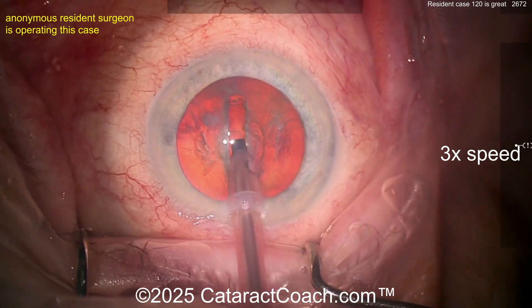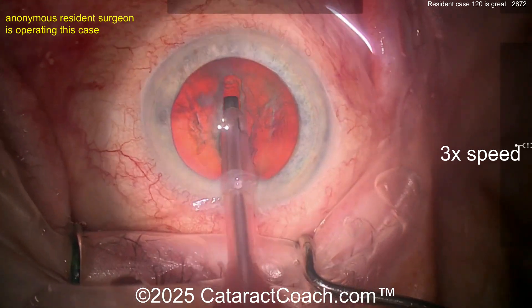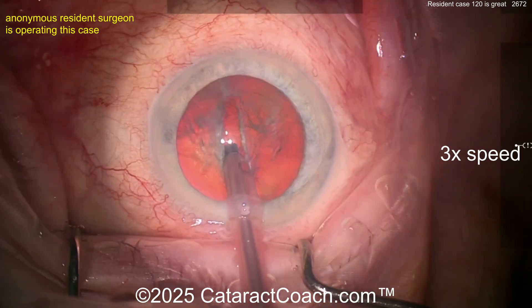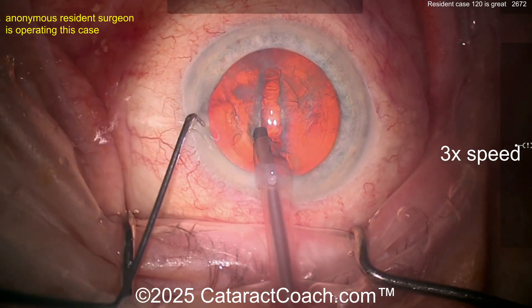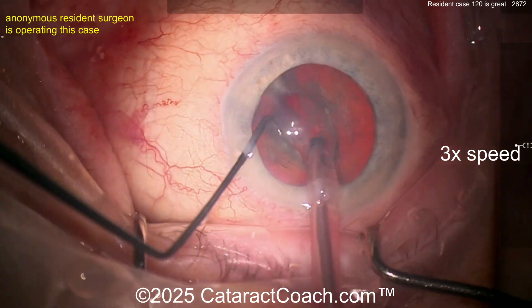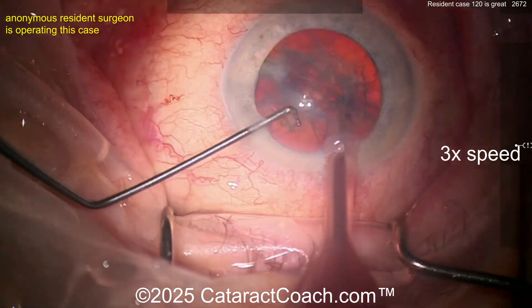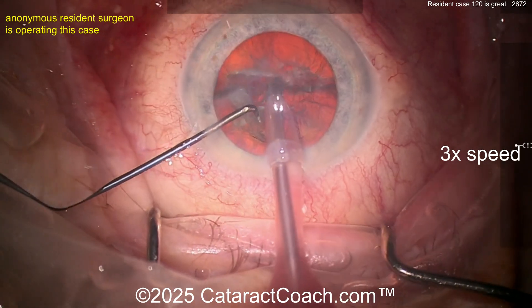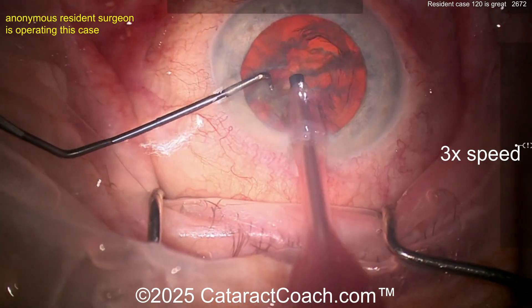Groove down the middle — we like that. Good looking groove, I like that. The eye is in focus and reasonably centered — pretty good job so far. If you're still learning, you may want to widen up the groove; it makes it easier sometimes to have smaller halves. Here comes the chopper — crack propagated down the middle. Propagate it fully, maybe do one more split there at the end.